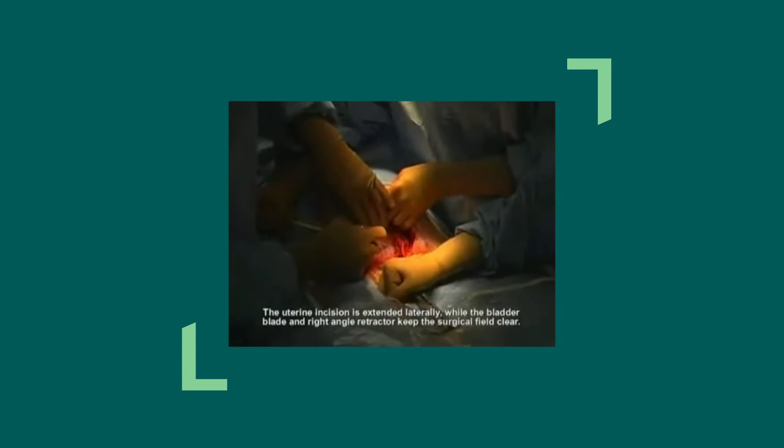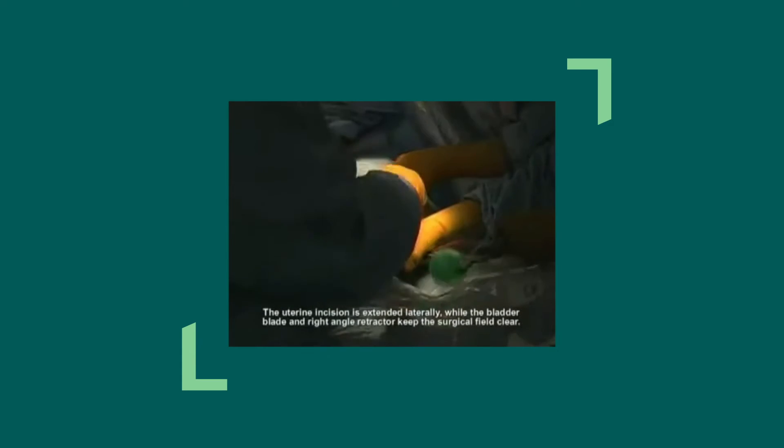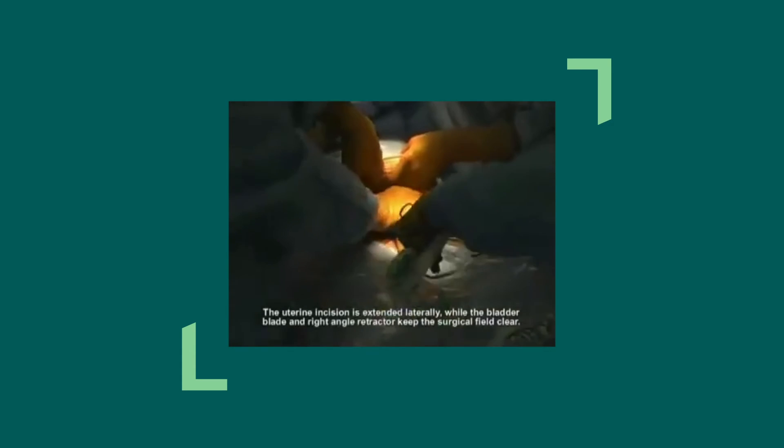The uterine incision is extended laterally while the bladder blade and right-angle retractor keep the surgical field clear and the amniotic fluid is allowed to drain.